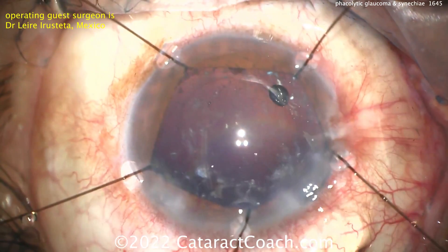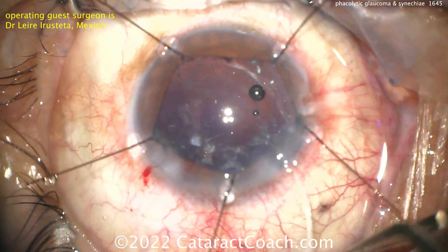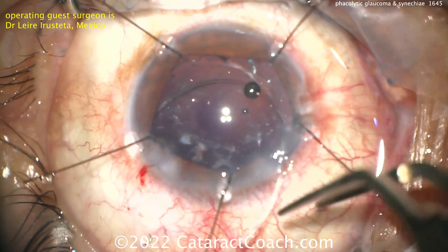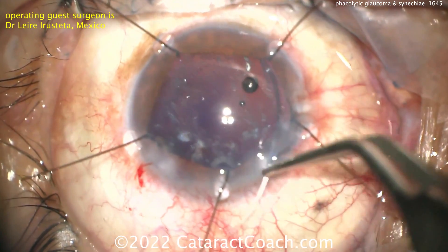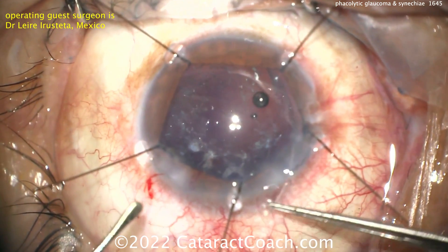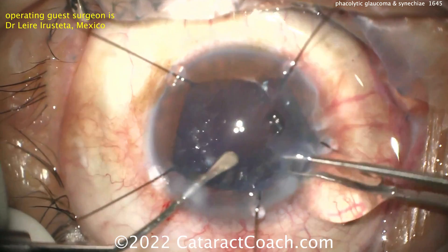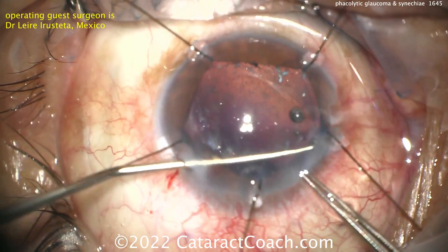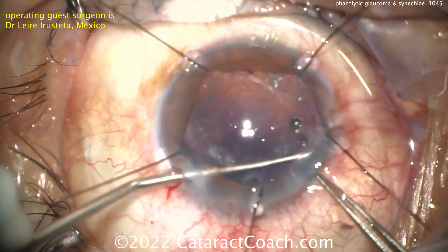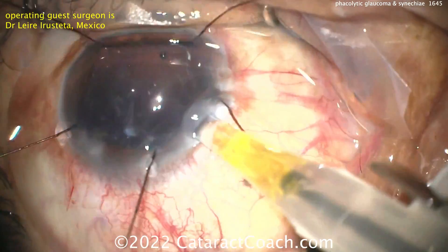Now filling in that capsule bag. A CTR — that's always a good idea. Placing the CTR in manually, nice and easy. Getting that leading part and helping guide it around. Going all the way in — get that dunked in the capsule bag. The CTR looks like it's placed — get that last arm in. Now it's in the bag.